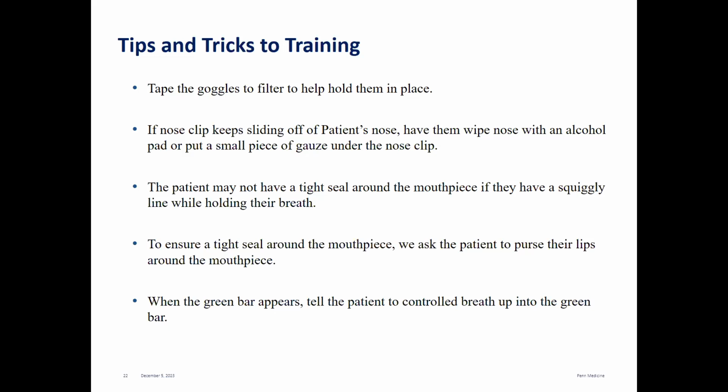The patient might not have a tight seal around the mouthpiece at all times. That was giving that squiggly line I was talking about. So you want to have them purse their lips around the mouthpiece, and this helps to remind them to keep that tight seal. You also want to tell the patient that when they get that green bar, they want to take a controlled breath up into the green. Sometimes patients will see that green bar and panic and do a deep breath in very quickly, and that causes an error that says the flow is too high for the SDX.